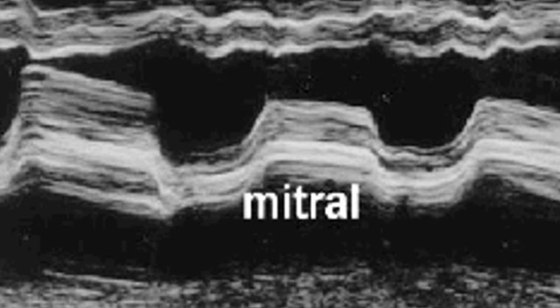You have to scan the beam everywhere at the valve looking for them. They will be seen only where there is a vegetation. Most of the valve may be normal. Here I cannot say there is a vegetation since it is formed by lines, but not there.